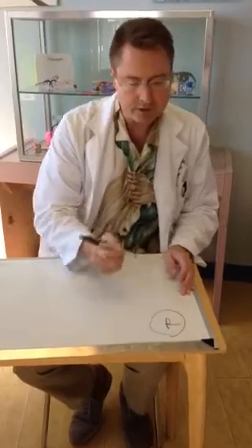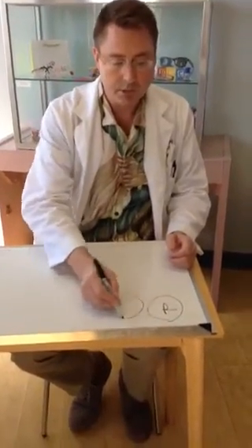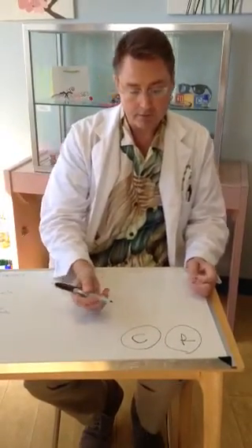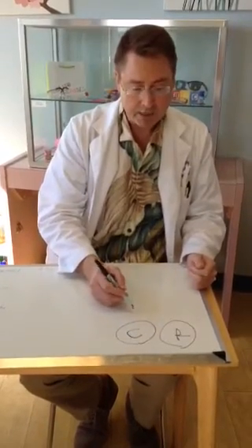First is the easiest, and that's just reading glasses. It does one thing well. The whole lens is dedicated to just close-up reading. Becoming more popular is the computer reading glass. That's at arm's length for computer reading. That works pretty simple, pretty straightforward.